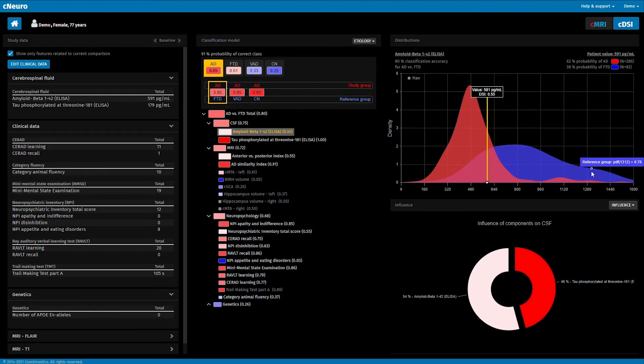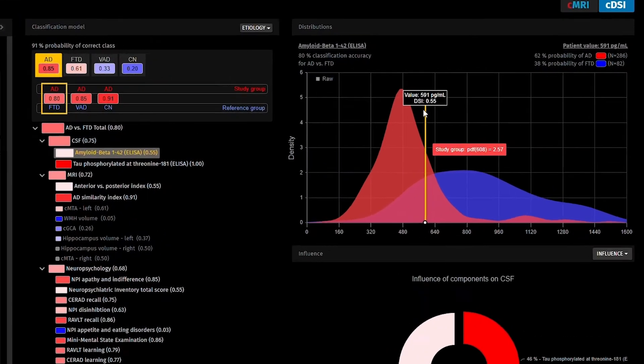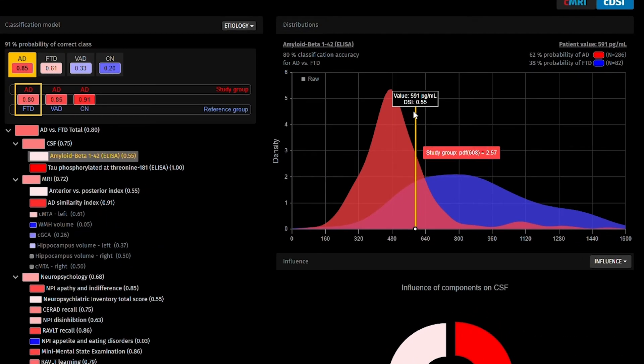A disease state index, or DSI, is then computed and indicates the probability that the patient belongs to the study group, which is AD in this case.